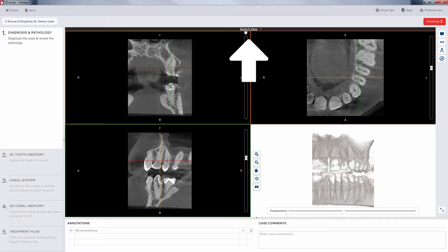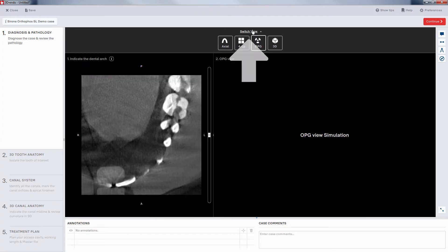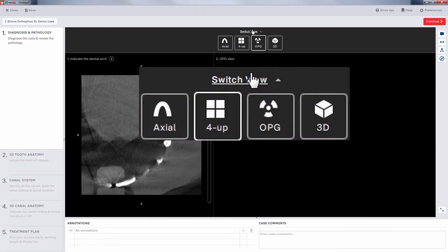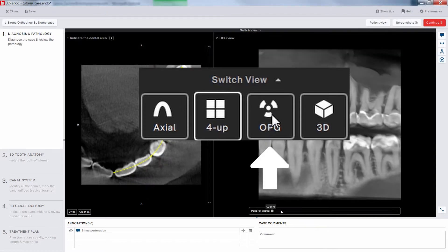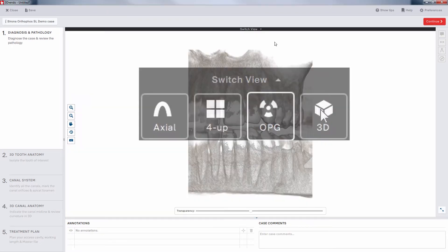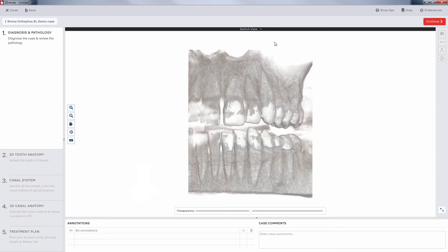Note that the View menu has hidden itself while we were moving around. To get it back, simply click on Switch View at the top of the section. Here is the OPG view, and the fourth option is the 3D view.